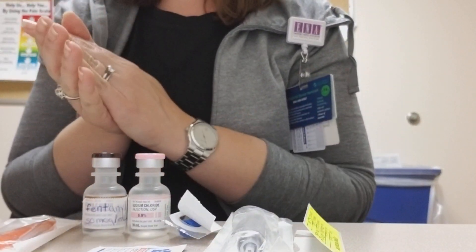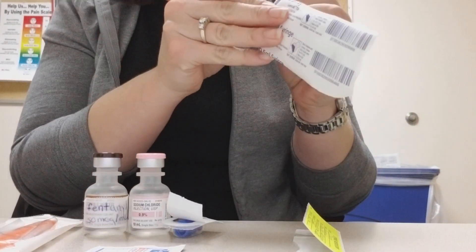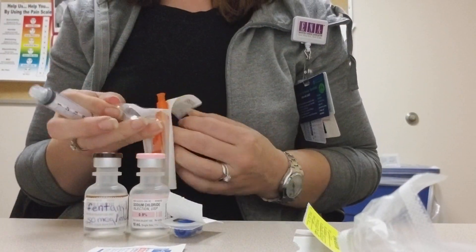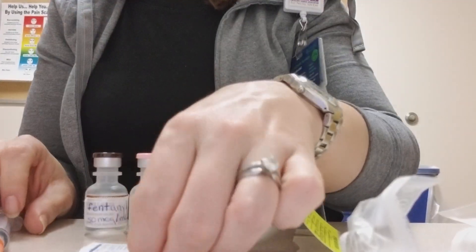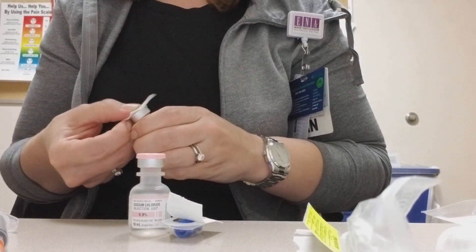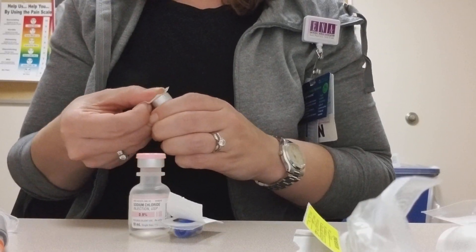Super simple — obviously we're going to wash our hands before we start and we can get our syringe and needle prepared ready to go. We're going to take our alcohol prep pad for our medication and clean it for a good 15 seconds before we pierce it.